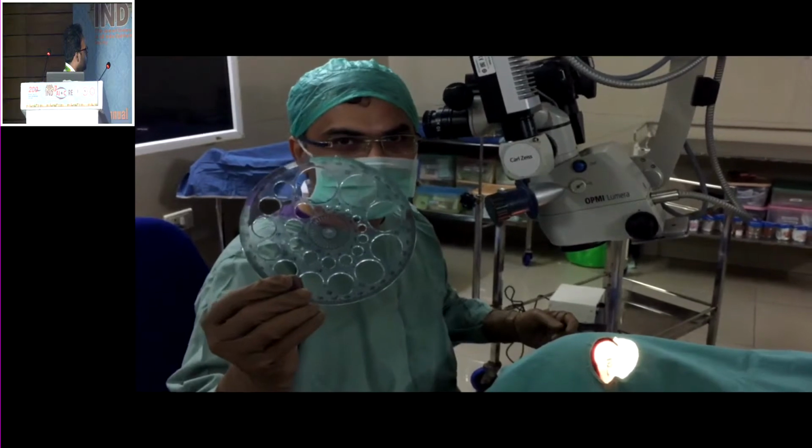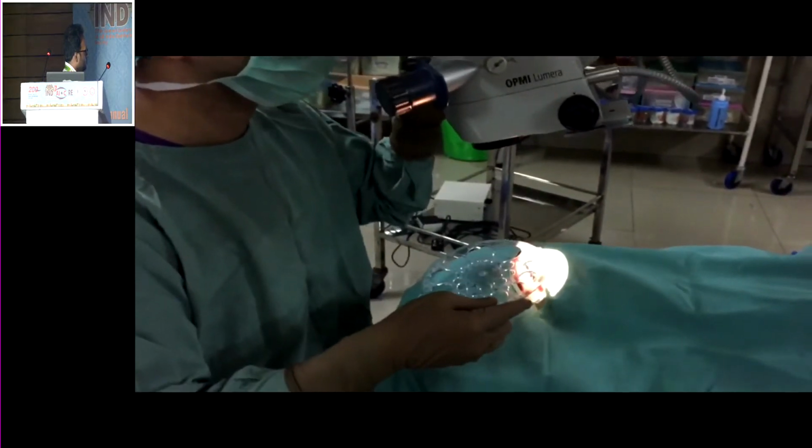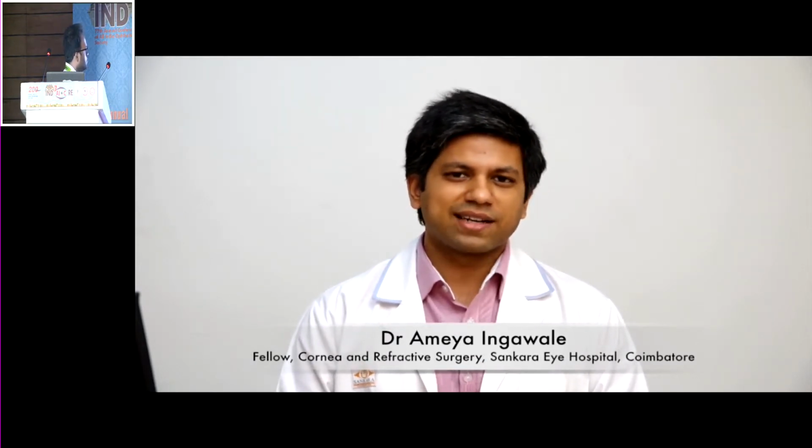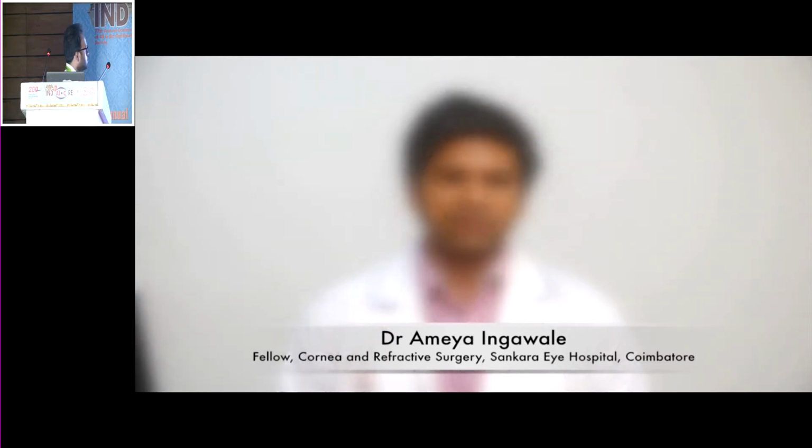So we had been assigned a task. It seemed pretty simple. We thought we'd use a Placido circle. So we went ahead and bought a Placido circle. But the Placido circle didn't work. Neither did we know the size of the mire, nor was it practical to use during surgery. Our device had to be simple. It had to be cost effective and easily mountable on any operating microscope. We needed to use it real time for assessment of titration of sutures. It had to be real time assessment, not post operative.